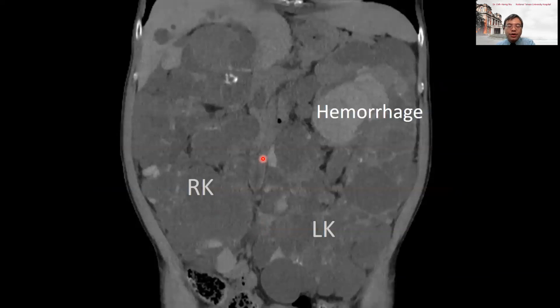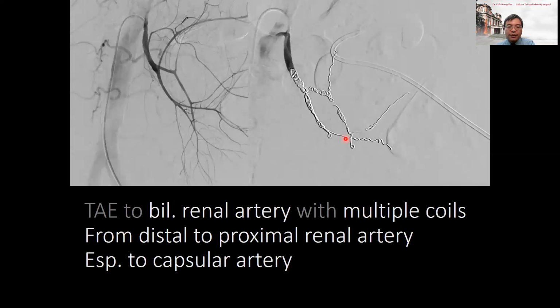In pre-intervention imaging, we can see that there are 2 large, huge kidneys with multiple cysts. And for the left kidney, you can see there's an image here. So in urine analysis, we can also see this effect.